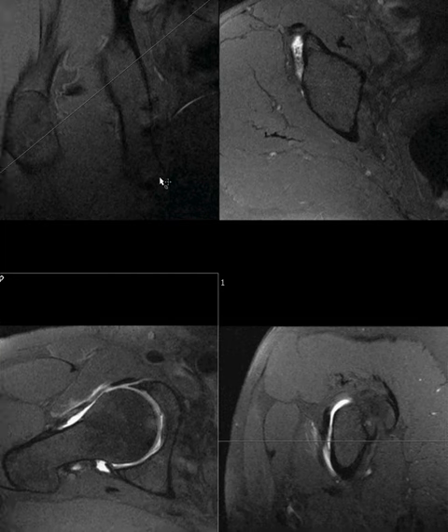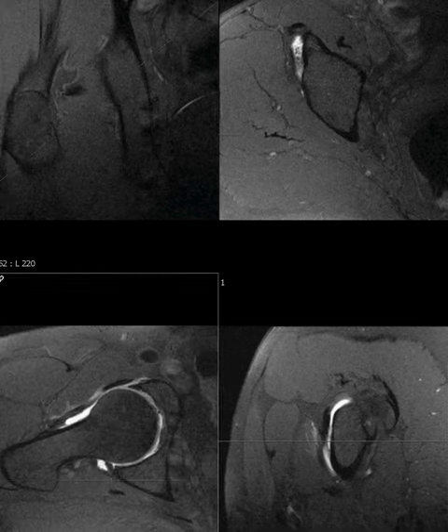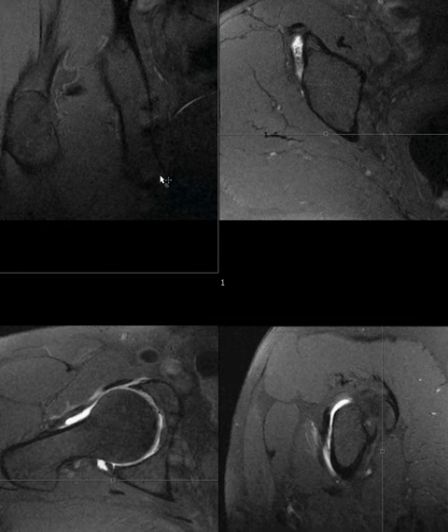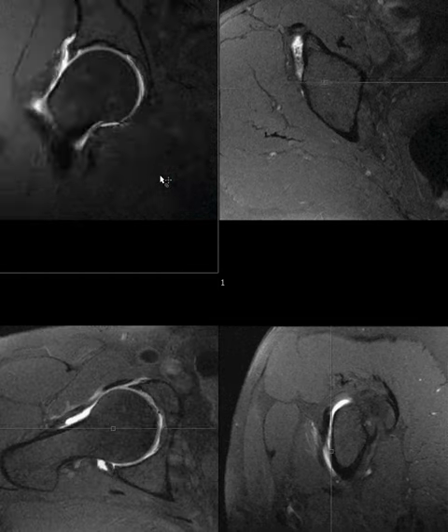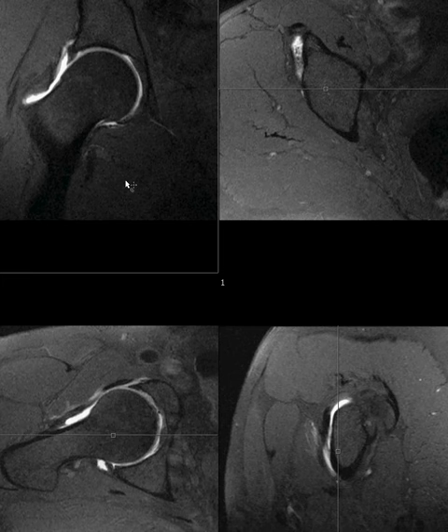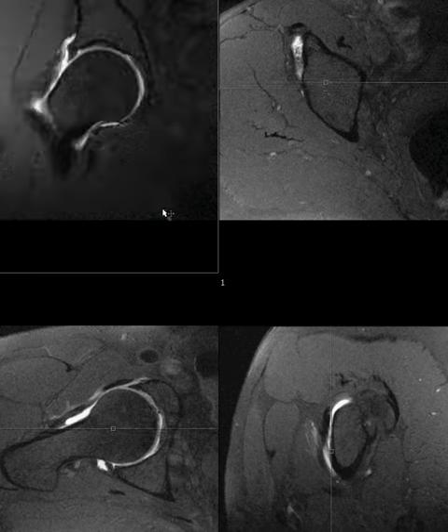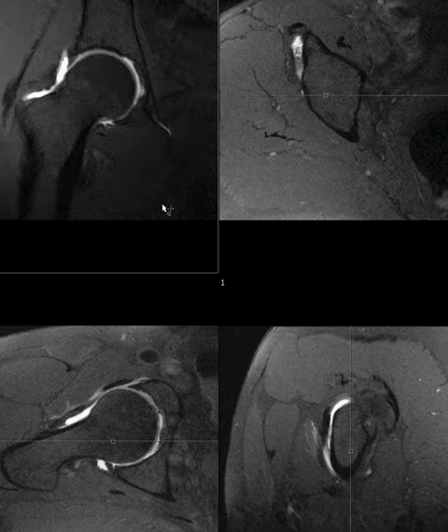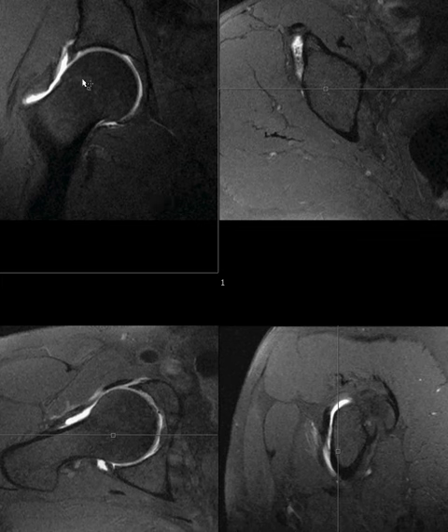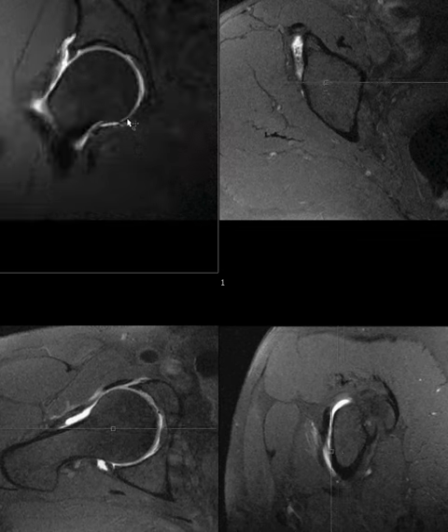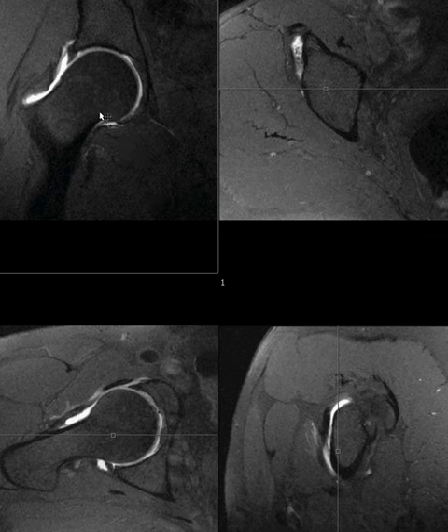This is an example of the image plane prescription that we do in the hip. This is an MR arthrogram of the right hip, and we're looking at a coronal image here. There's the contrast in the joint, and this is the normal standard coronal plane.